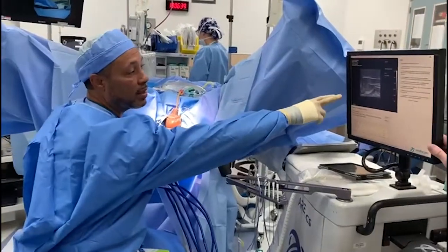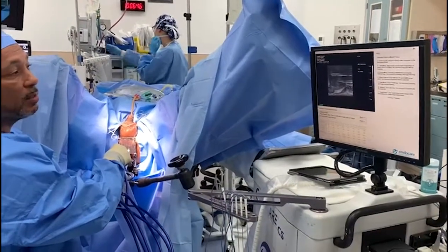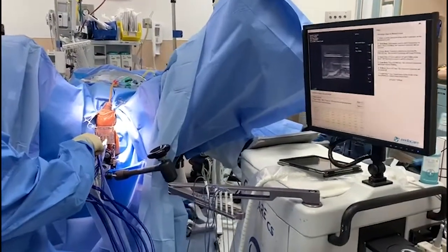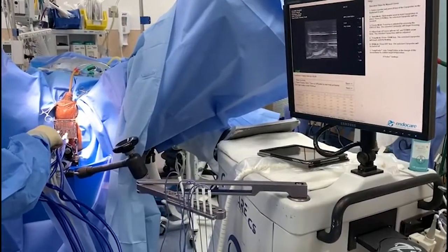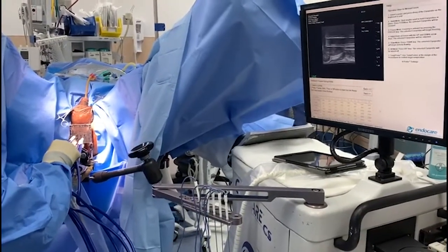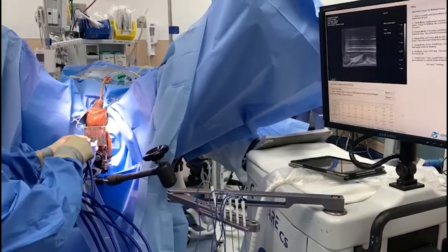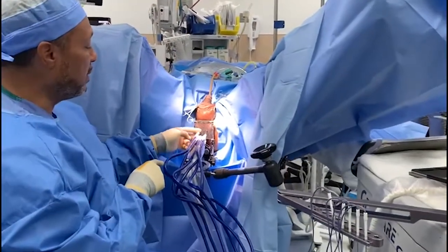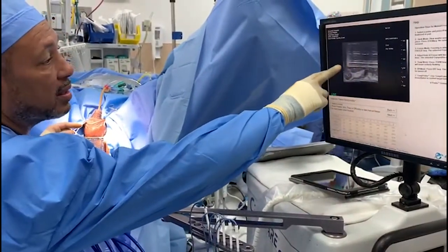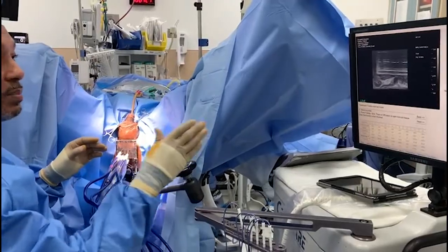On the right side, our number one probe is anterior — we're going to the edge of the prostate all the way to the bladder. Then we have my mid-gland probe, placed mid-gland. My third probe on this side is the medial-posterior one, placed right here. They should be fairly symmetric — when you're done, these should evenly be the same length generally. I'm going to change the freeze length to tailor this procedure to this patient's prostate.